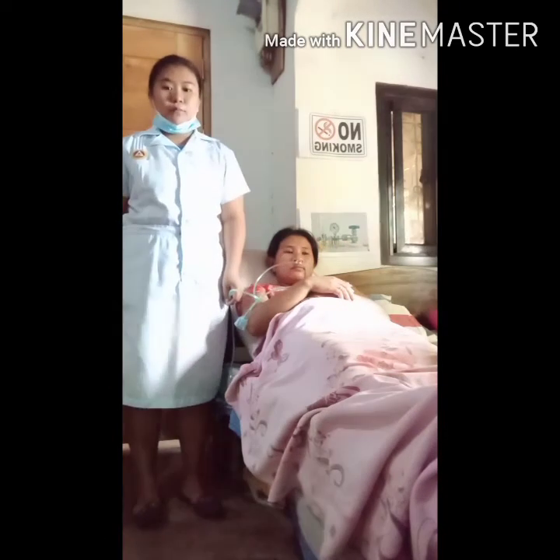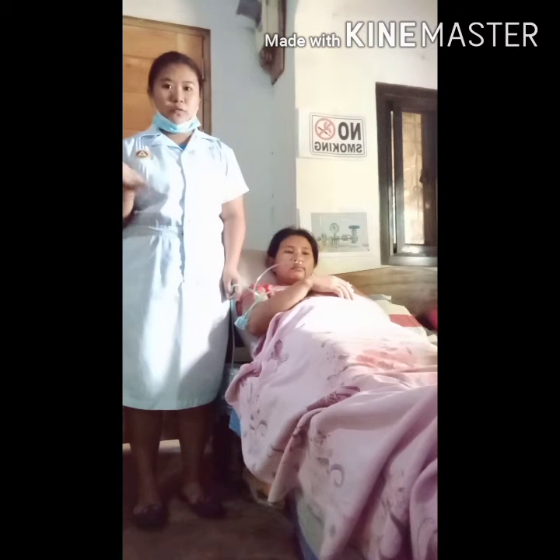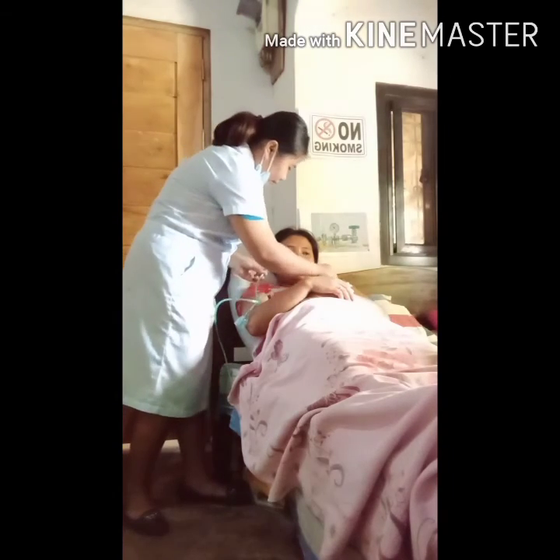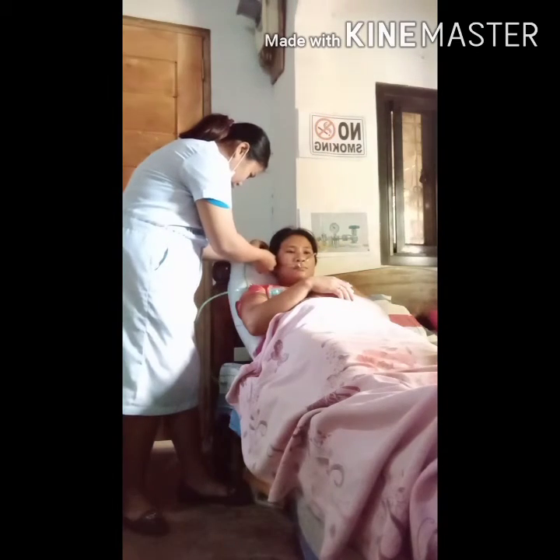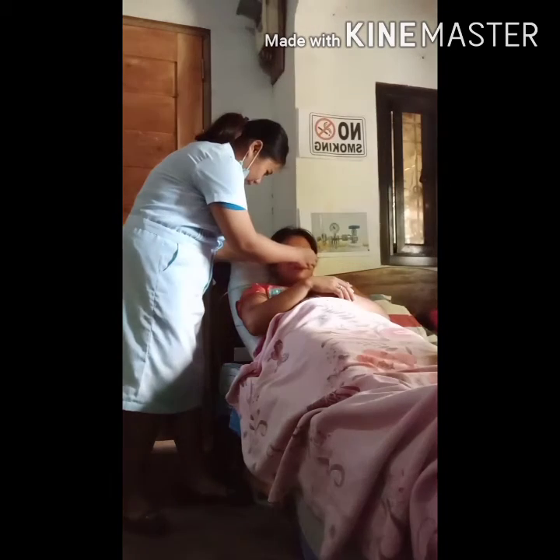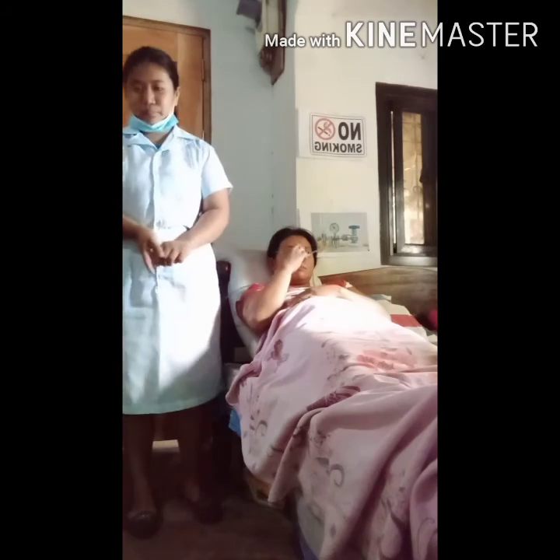And then wrap the tubing over and behind the ears. And then place gauze at the ear beneath the tubing as necessary.